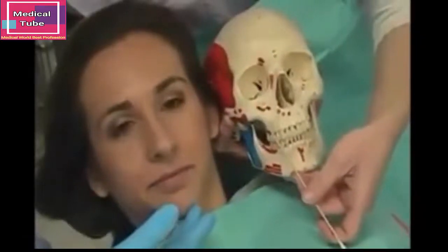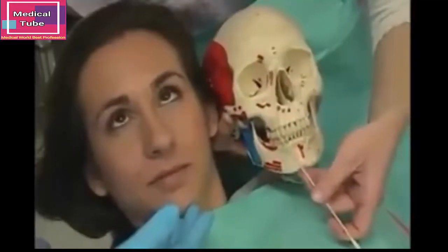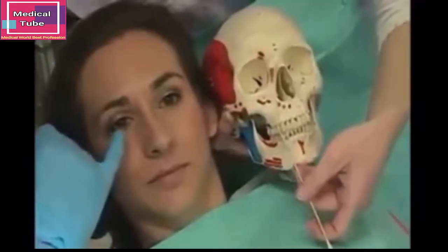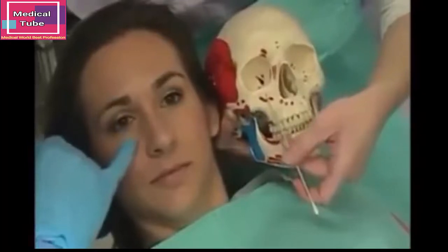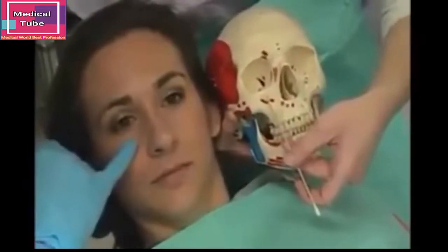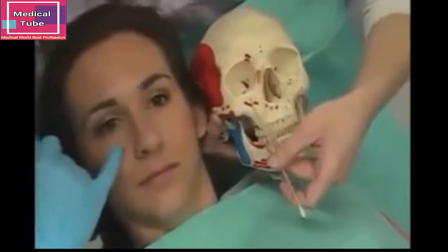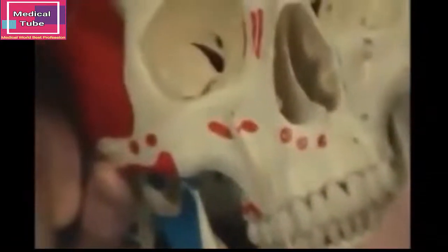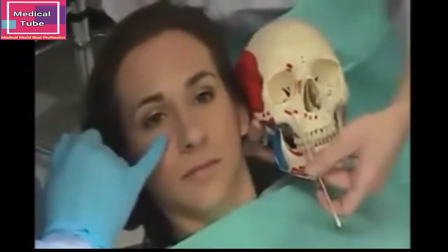Start off by having your patient have their eyes open looking straight ahead. The reason for this is that more often than not, if you draw an imaginary line from the pupil of her eye straight down and intersect that with the inferior border of the orbit here, that line will lie right on line with the actual foramen, as Heather is demonstrating on the skull there. Oftentimes, if you palpate that area, you can actually feel the depression there. So this is our target area.